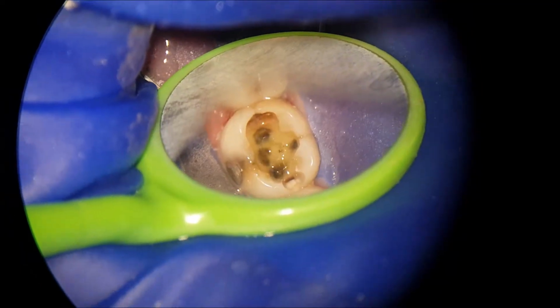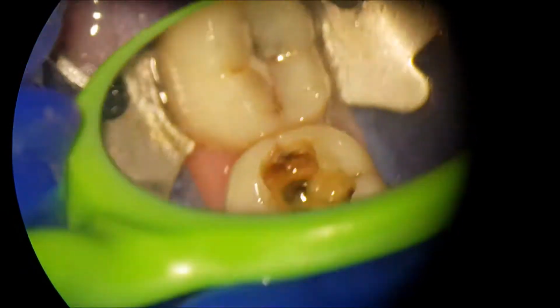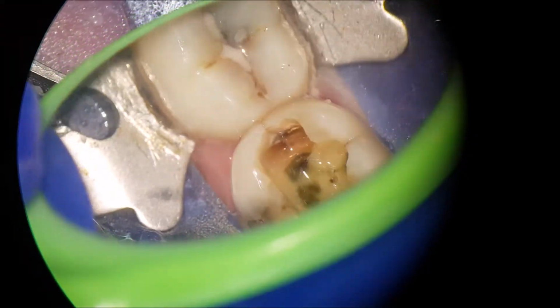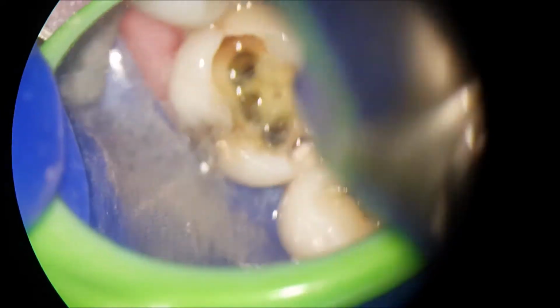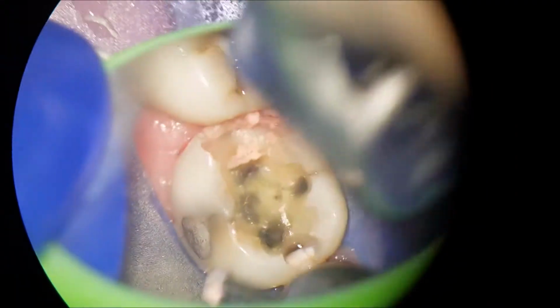Removal of the amalgam, revealing stress fractures. I want to go as far as to say all amalgams have some form of a stress fracture somewhere, and if you don't agree, then may I suggest that you invest in a microscope. These cracks are very common. Obviously there will be exceptions, but in my opinion 99% of amalgams will have a stress fracture somewhere.